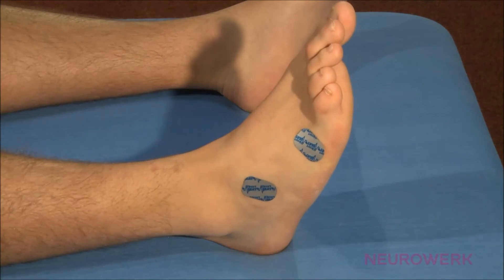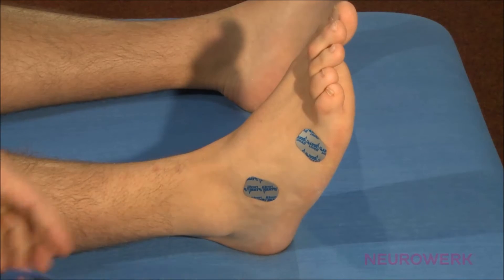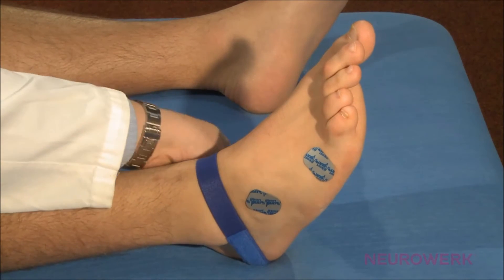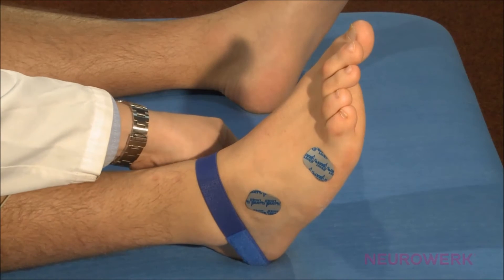In the motor neurography of the peroneal nerve, the different or active electrode is positioned above the extensor digitorum brevis muscle. The indifferent or reference electrode is attached to the first joint of the little toe. The ground electrode is fixed proximally from the recording electrodes.